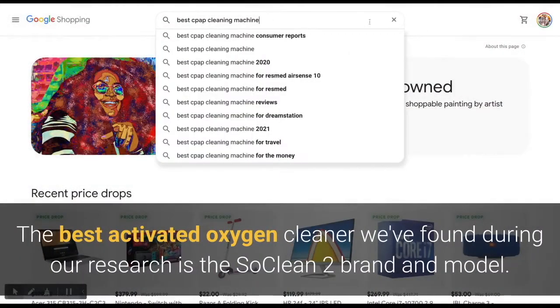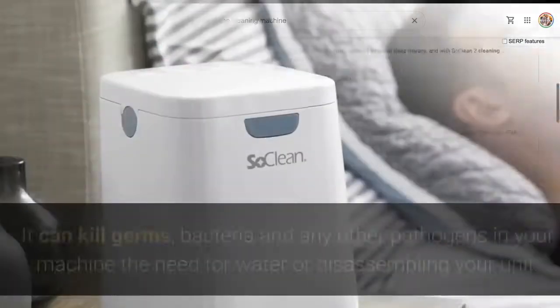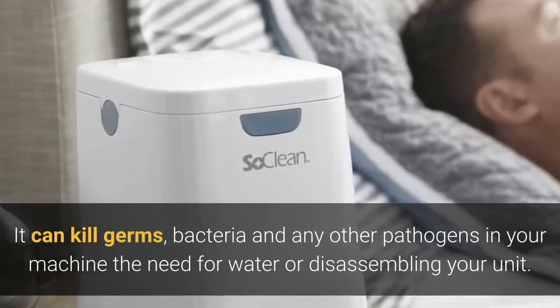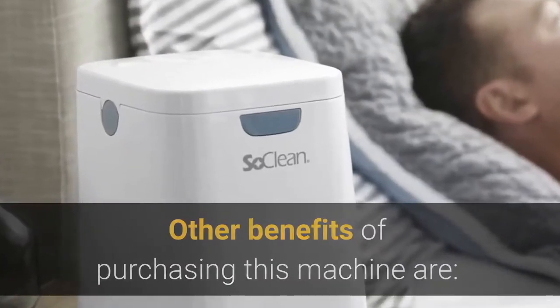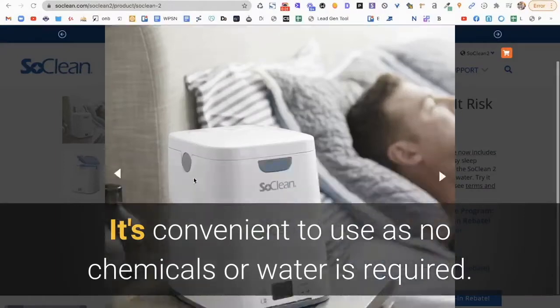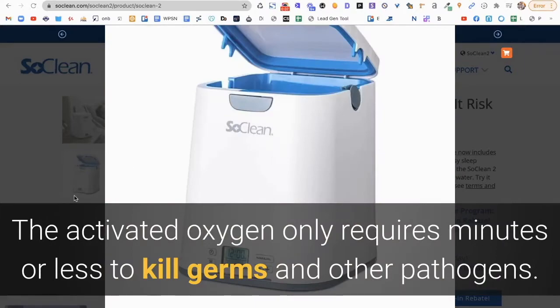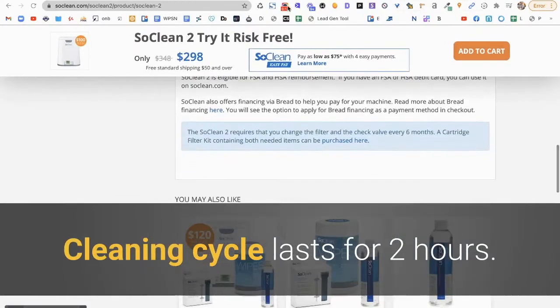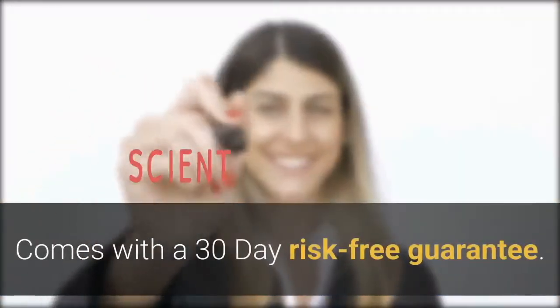The best activated oxygen cleaner found during our research is the SoClean 2. It can kill germs, bacteria, and other pathogens in your machine without the need for water or disassembling your unit. Other benefits include: it's convenient to use as no chemicals or water are required; activated oxygen requires only minutes or less to kill germs and pathogens; the cleaning cycle lasts two hours; if purchased directly from the company they offer payment plans; and it comes with a 30-day money-back risk-free guarantee.